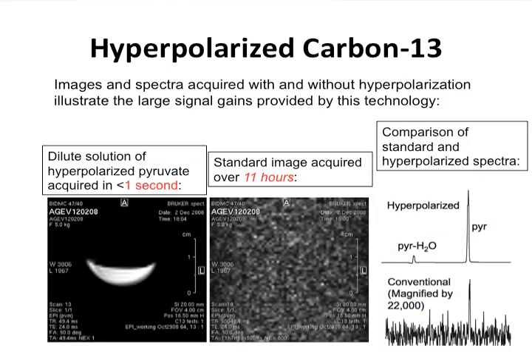So here's an example just illustrating the kind of signal enhancement that you get with hyperpolarization.